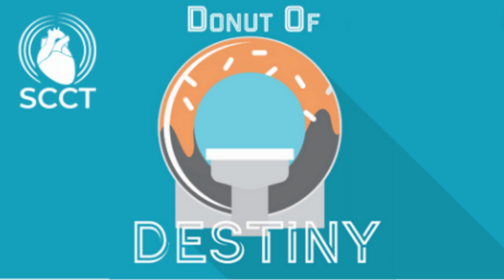Charley, that's fascinating. How actually is the VTM ratio calculated using the CT data sets? Yeah. So from the coronary CT, we extract all of the vessels, we do this anyways with FFR CT, all the vessels that we can really see down to a millimeter, even a little bit less than a millimeter in size. And we segment all of those vessels, and then we calculate from that surface, so the luminal surface for all the vessels, we just look at the interior volume from that. And it's a simple computer graphics calculation to get the total volume.